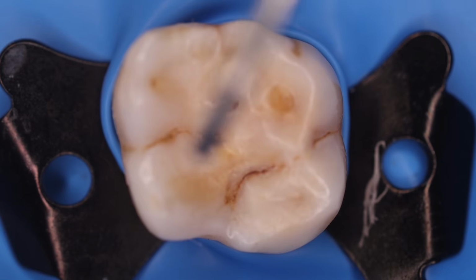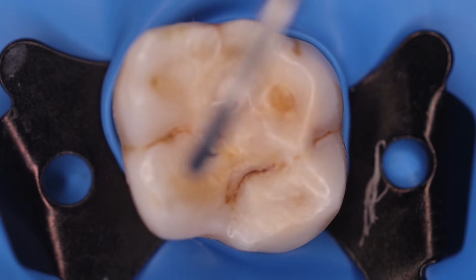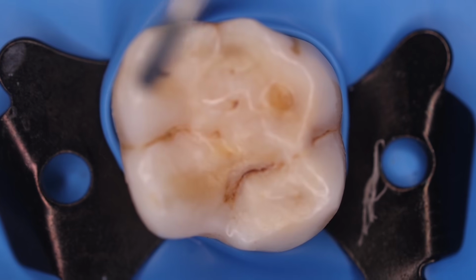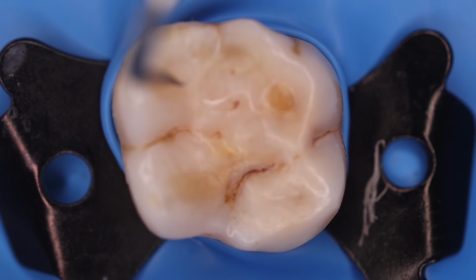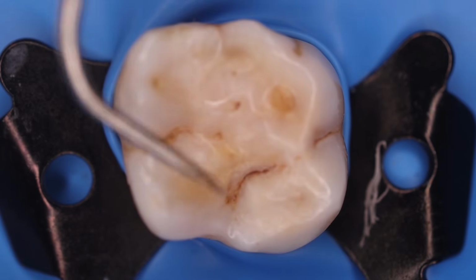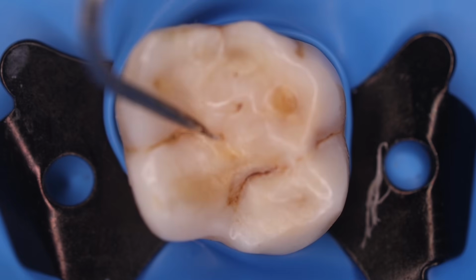So we will begin at the center and we will be considering the approach that involves the mesiobuccal cusp, as we will most probably be able to find the mesiobuccal canal right beneath the mesiobuccal cusp. This access cavity would be a straight line access, that is, you would be able to see all the canal orifices directly in one vision.